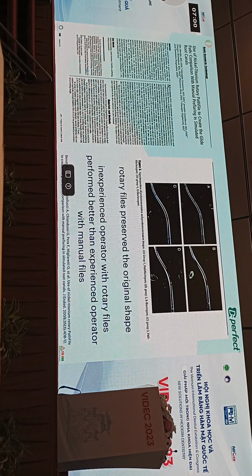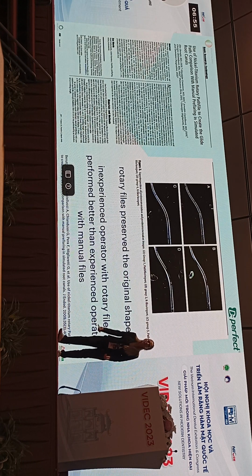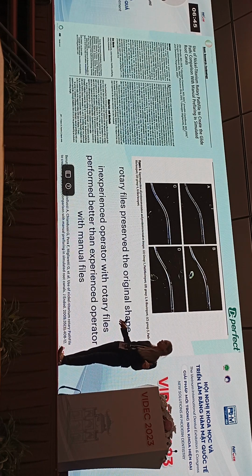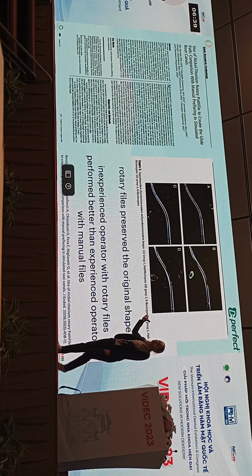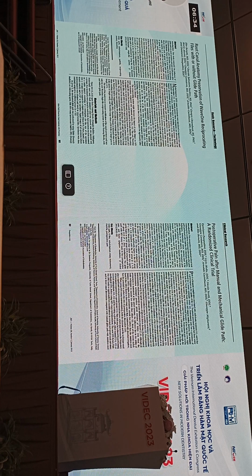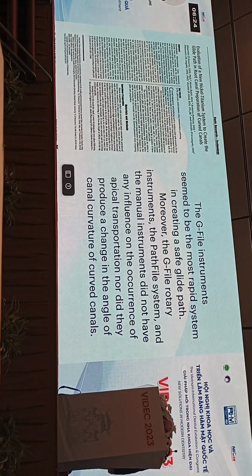And this is a study by the University of Turin, Professor Elio Berutti, which is an endodontist with I think about 40 years of experience, did the glide path in an S-shaped canal with manual files. Then he picked a student of the 4th year who had never used the rotaries before. He gave him rotary files and the student performed better than him in his first time use, because rotary files are easy to use. And in this way, we preserve the anatomy and we have less post-operative pain.